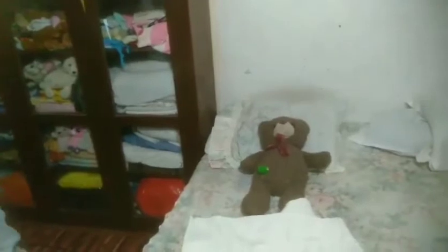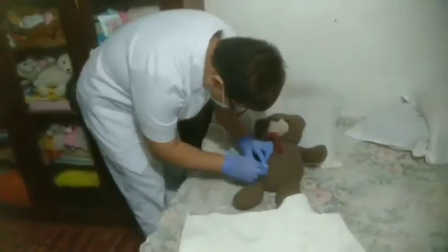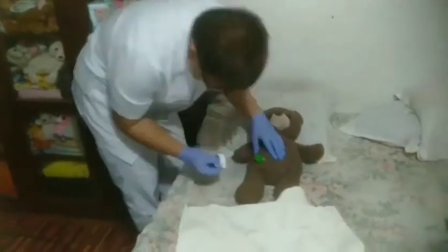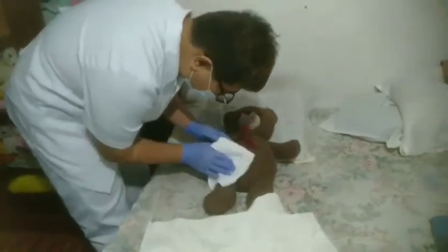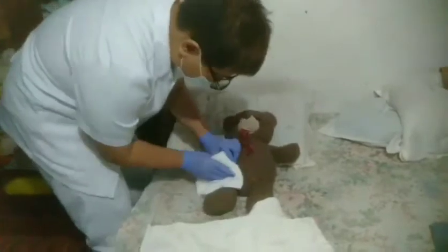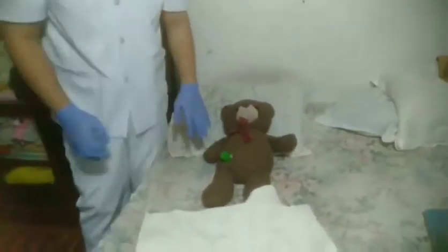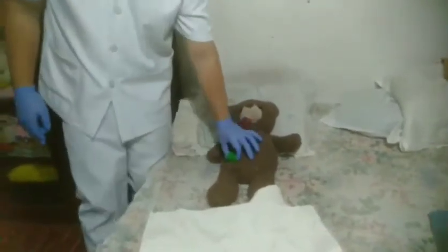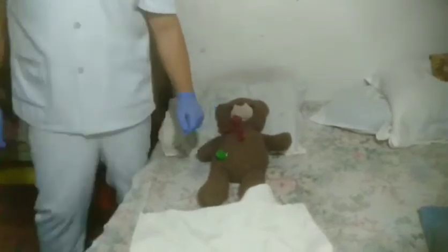Then make sure you use a special skin cleanser to remove dried or hard stools. Also, after you remove that, make sure to dry the area thoroughly by patting with a towel or cotton balls around the client's peristomal skin and the stoma. Okay, make sure to inspect the stoma for color, size, shape, or any bleeding. Inspect the peristomal skin for redness, ulcers, or irritation.